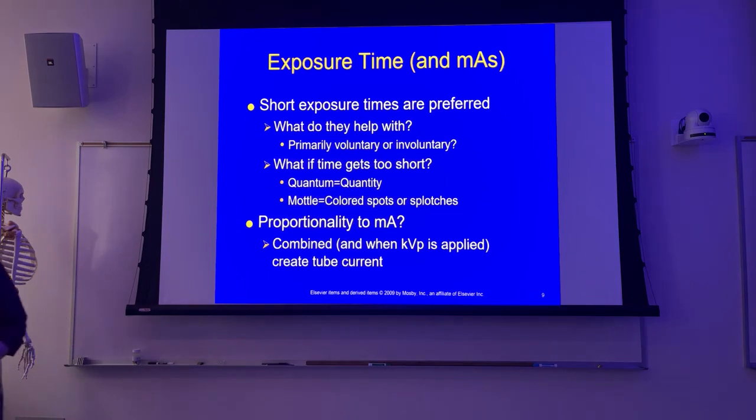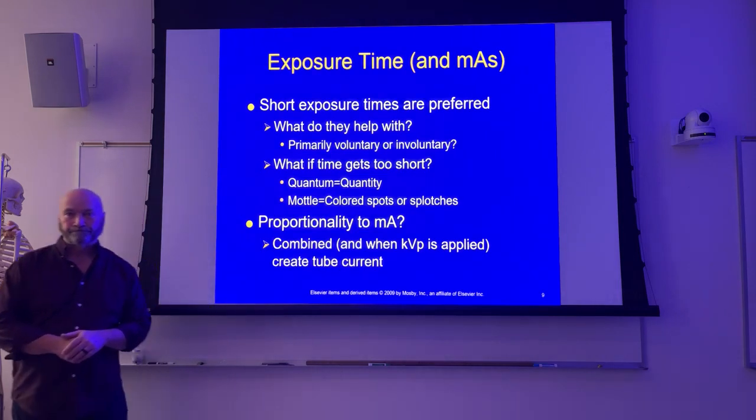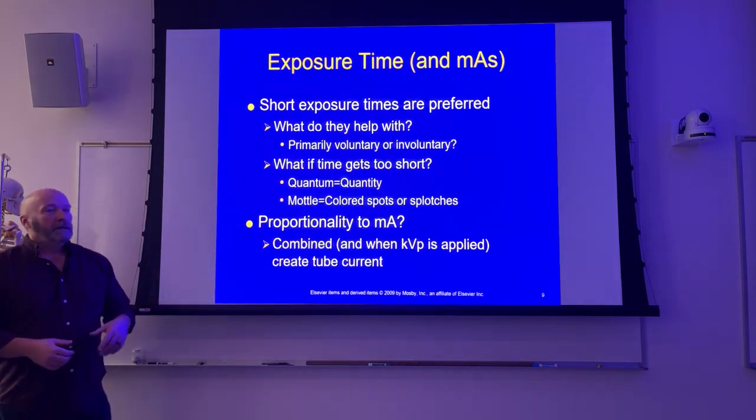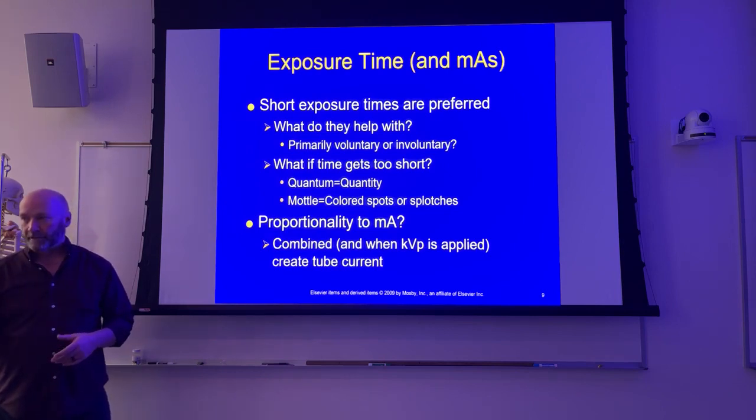Deep breath in and hold your breath. Why? Why would we want the patient to hold the breath? Motion. We want to eliminate motion, right? So regardless of the patient's ability to cooperate, motion is still a potential issue, right?